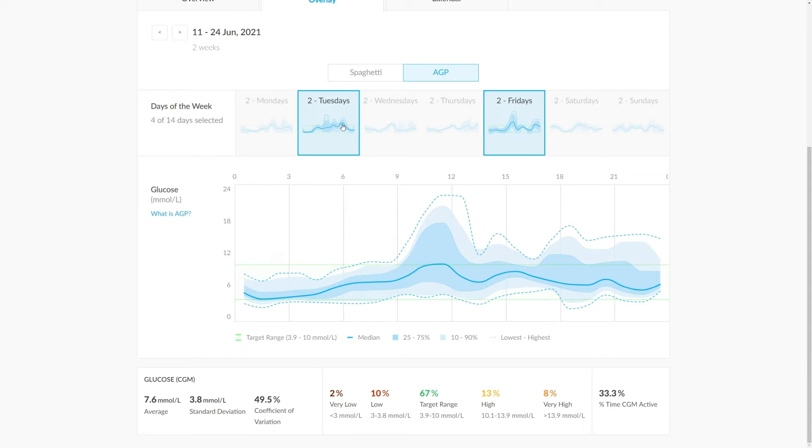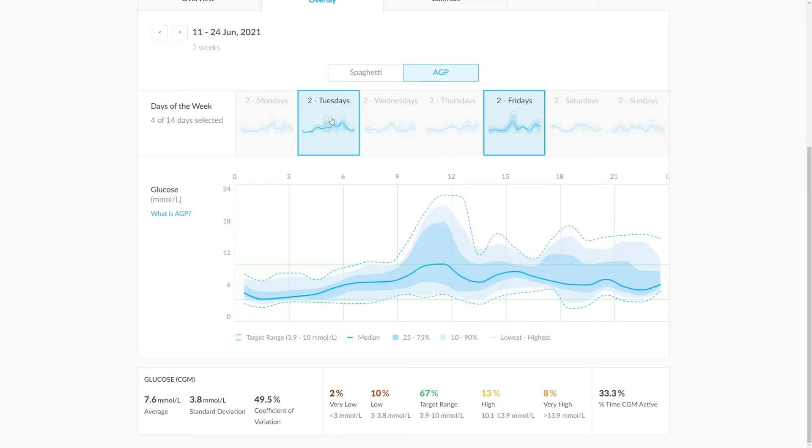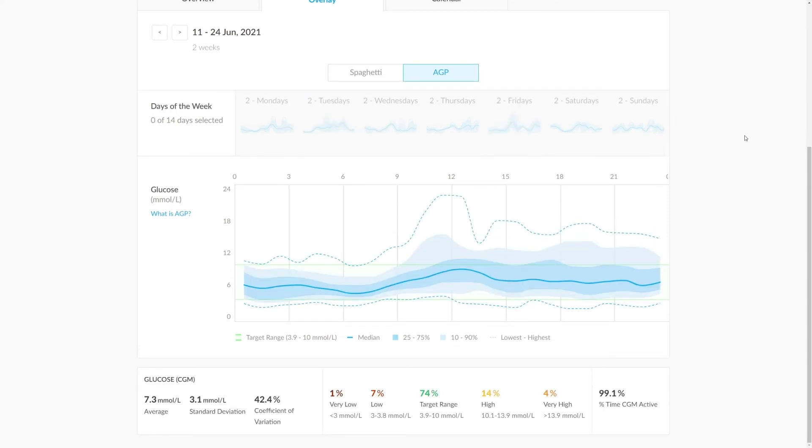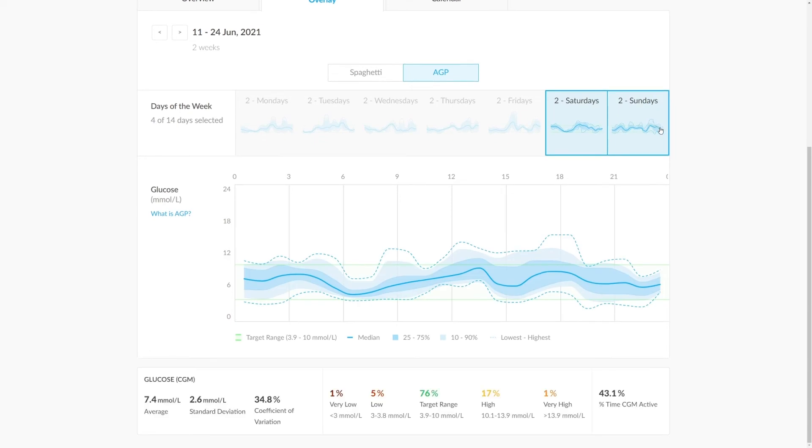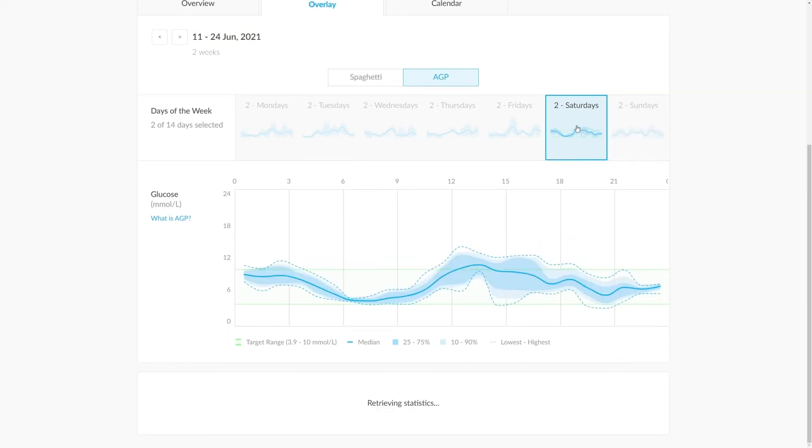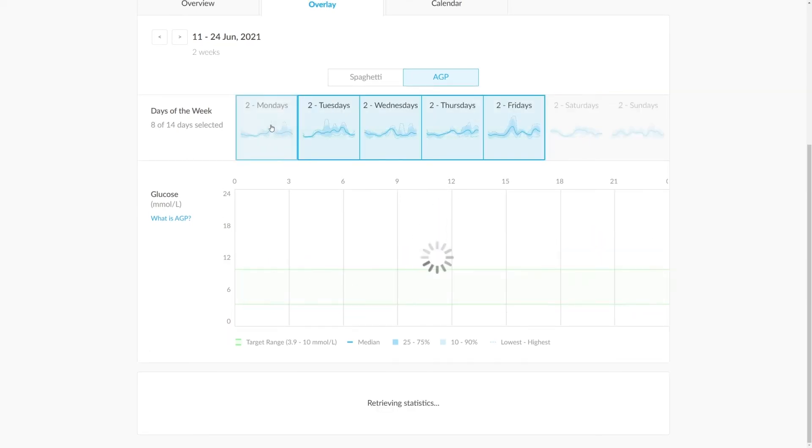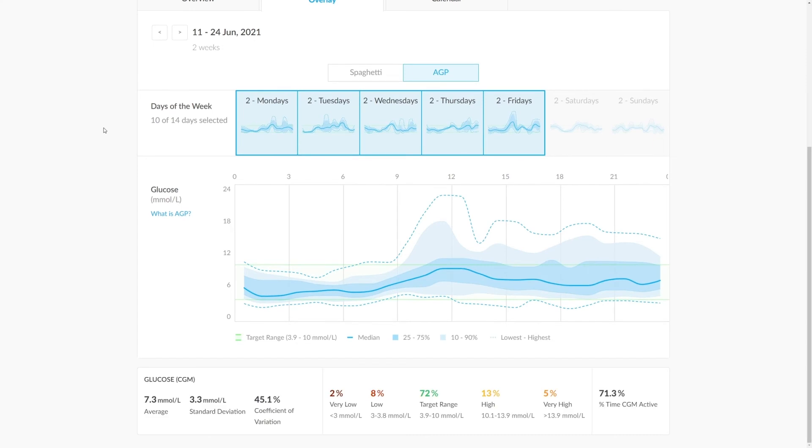If we wanted to deselect that, we could get the AGP for this entire two-week period, or we can even isolate specific time periods, for instance weekends or even the working week, which can be difficult for patients to manage. After we've done that, we can scroll down and look at the metrics below.